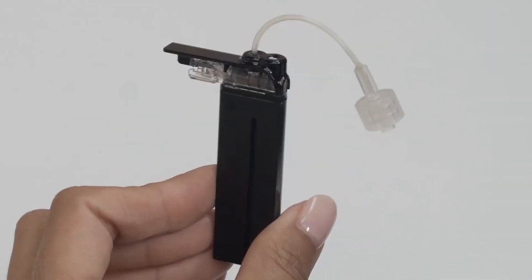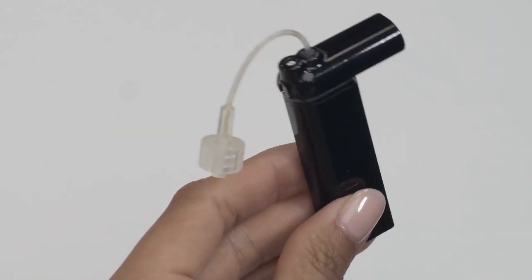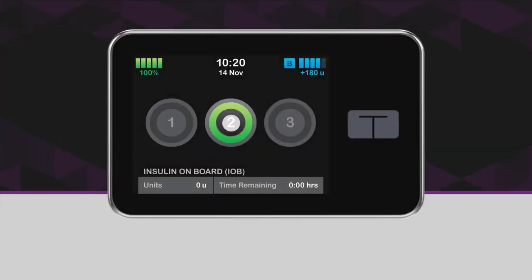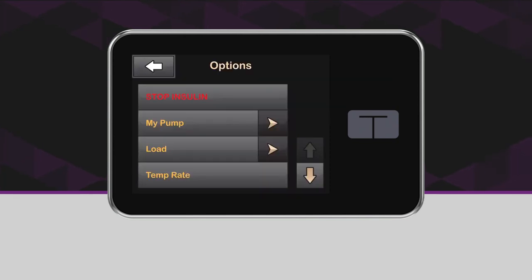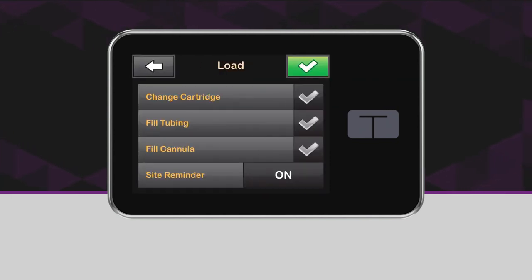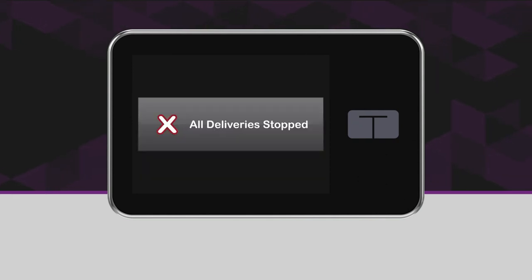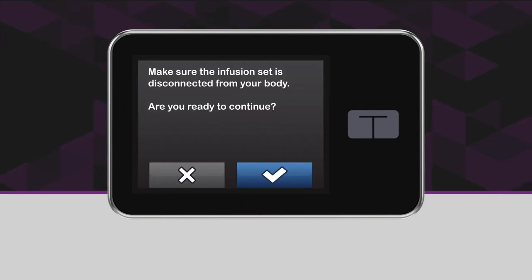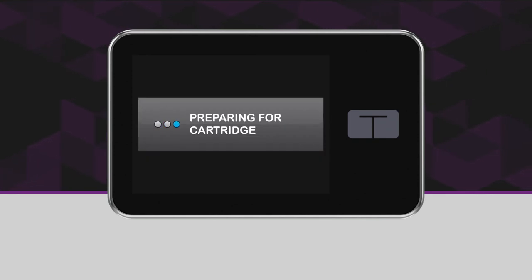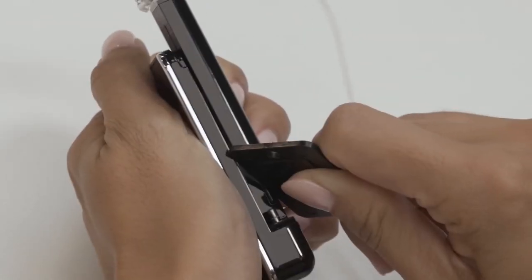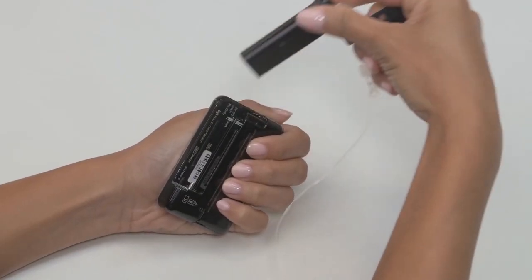If everything looks good and there are no leaks, you've successfully filled your cartridge and are ready to install it onto your pump. Now turn on and unlock your pump, and from the home screen tap Options, then tap Load. Next, tap Change Cartridge. The pump will tell you that all deliveries will be stopped, which is fine since you don't want to be trying to pump while you're changing your cartridge. So tap the checkmark to continue. Next, you'll be prompted to disconnect your infusion set from your body. Tap the checkmark to continue. You should see the Preparing for Cartridge screen.